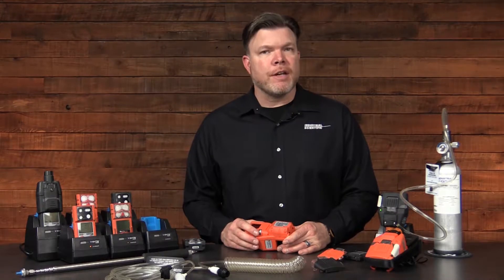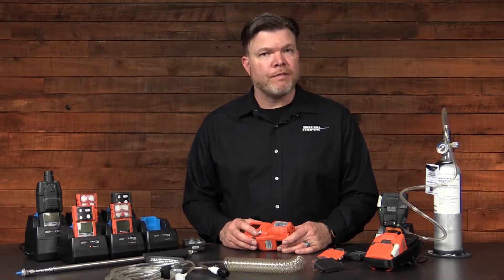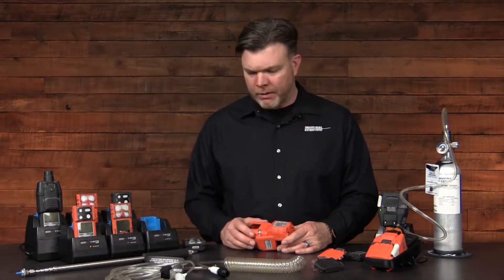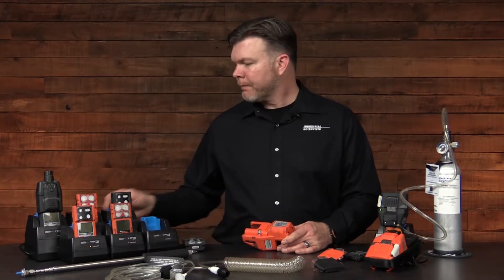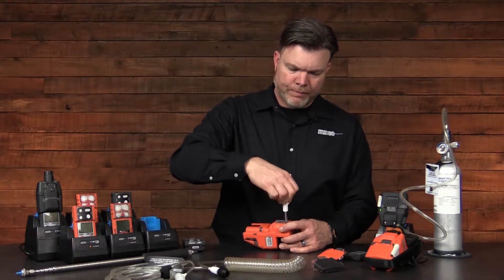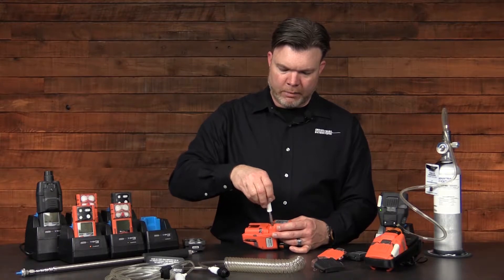Another routine maintenance item could be the replacement of the battery itself, and these are replaced just the same as they are on the Ventus family instruments. There are four screws that retain the battery — either the lithium ion extended range, the standard lithium ion, or the alkaline battery pack. With the appropriate driver, simply loosen the four screws all the way around the battery pack.